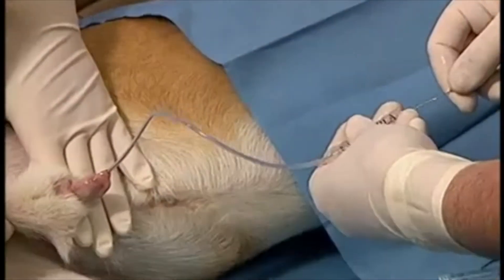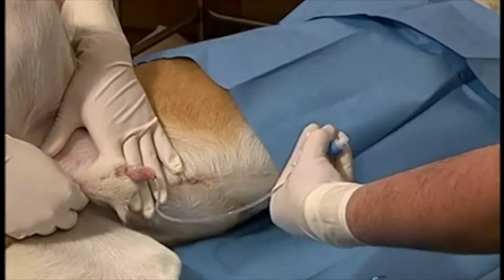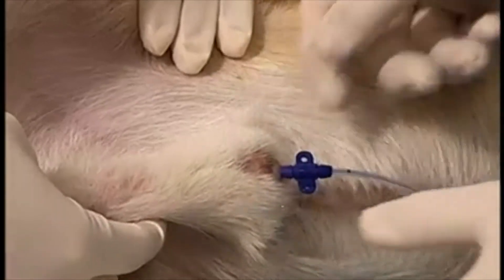Once inserted to the desired location, the stylet is removed. If there are difficulties in removing the stylet and there is bunching of the catheter, the catheter is stabilized near the urethral orifice while the stylet is removed.